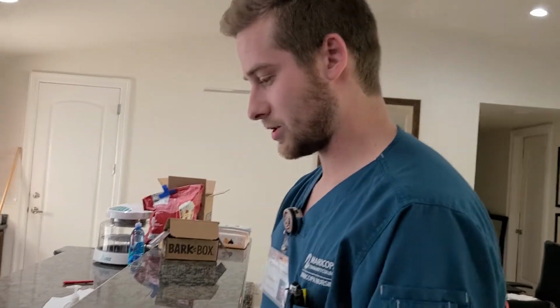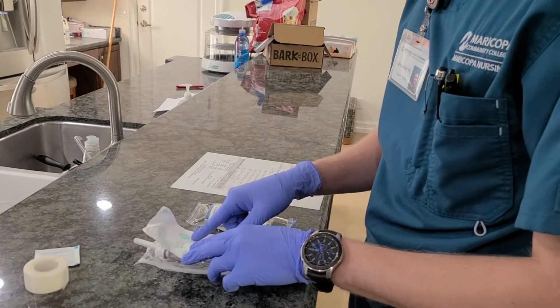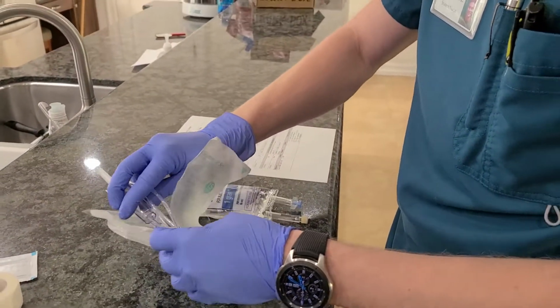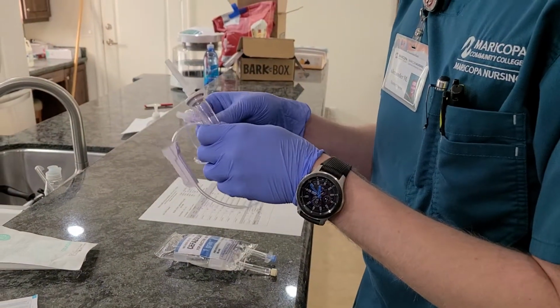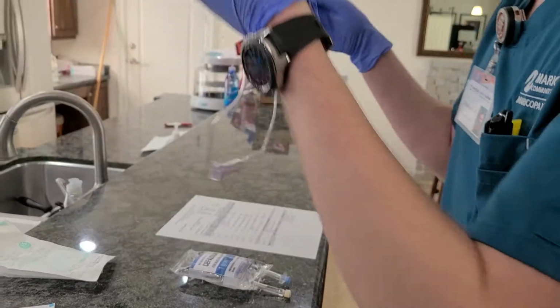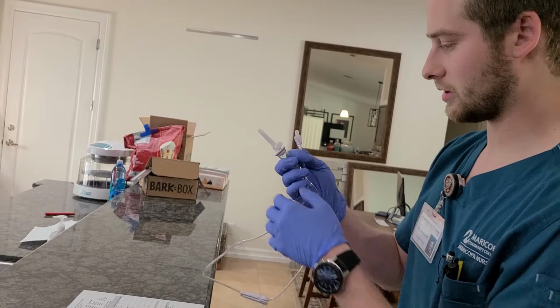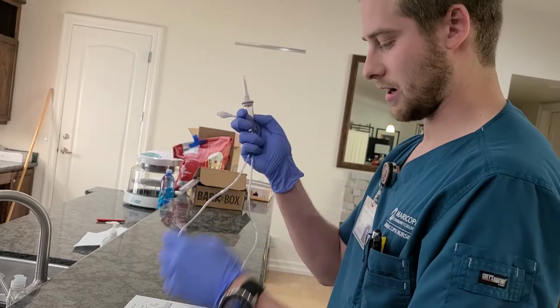I already did my second check. I have my IV set kit, which is 15 drops per milliliter, the correct rate that we need to hang it. I'm going to put this aside. I'm going to make sure I untangle it and make sure it is clamped, which it is, so we don't lose the medication. Now we're going to get ready to spike the bag.